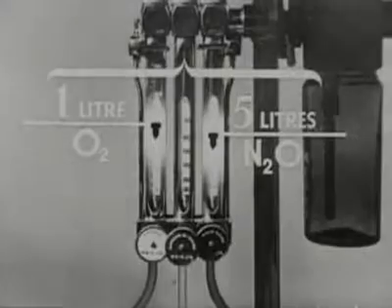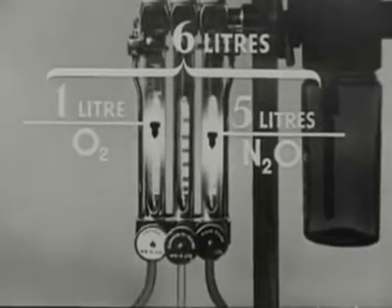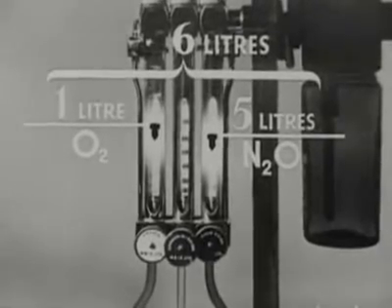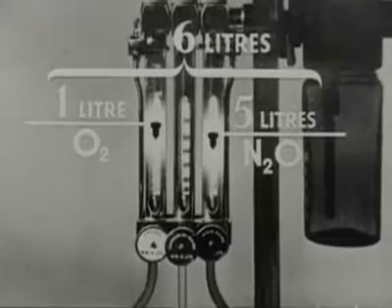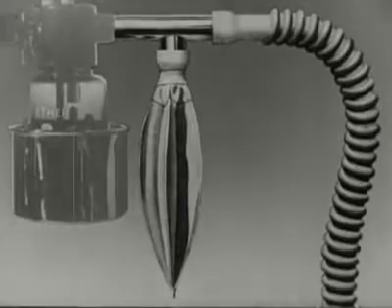The patient is now being given a total of 6 liters of fresh gases a minute. His minute volume is probably about 8 liters. So that 3/4 of what he breathes will be fresh gases and 1/4 expired gases. This is called partial rebreathing. The rebreathing bag acts as a reservoir.